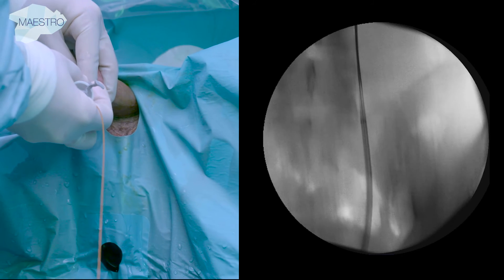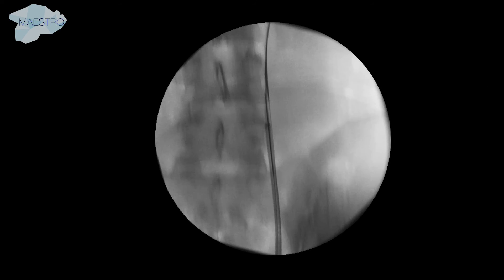When the sheath is safely in position, the inner obturator and the working wire are removed.